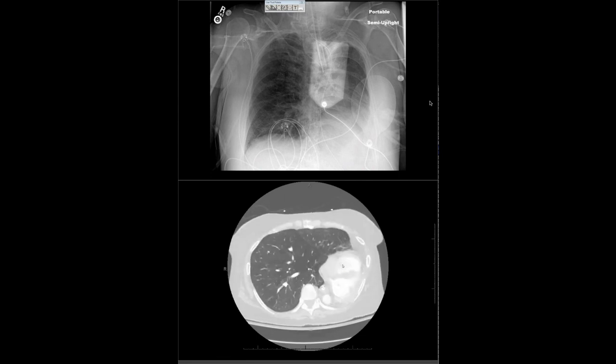Hey, Brian, I think another good point on your case, this is a nice example when there's really no visible pneumonectomy cavity. In my experience, I've seen that primarily with patients that had a pneumonectomy as a child, as opposed to most of our adults, who are left with some sort of residual pneumonectomy space. And I think maybe when they're children, the other lung's still growing and it's able to sort of fill out the space more. I don't know the reason why the fluid in the pneumonectomy cavity clears, but I don't know if anyone else has had that experience as well. Maybe the tissues are just more supple and elastic, and they can stretch to reconfigure more easily.